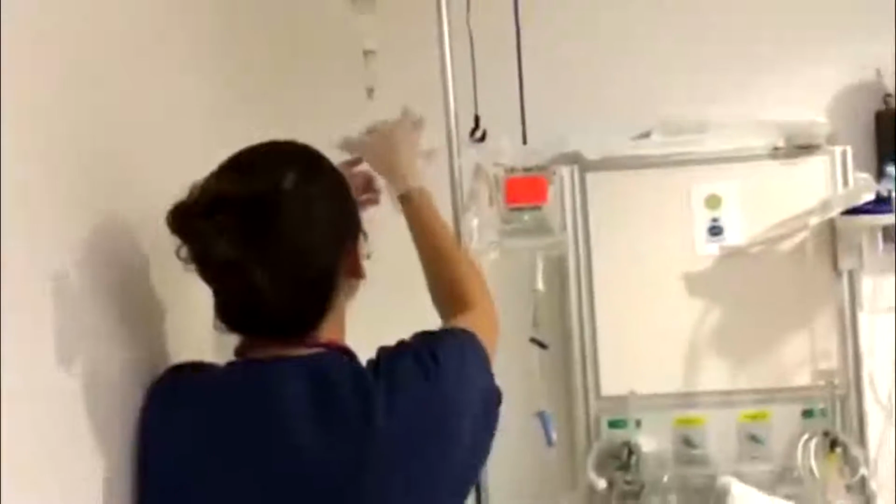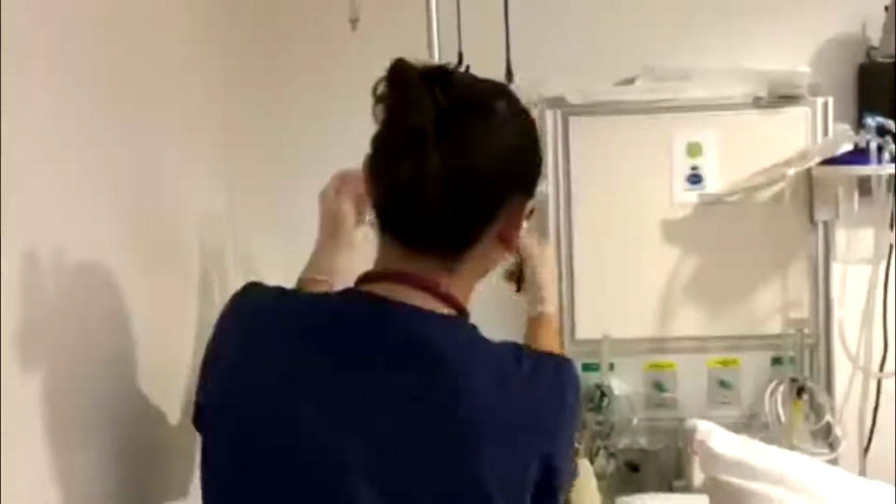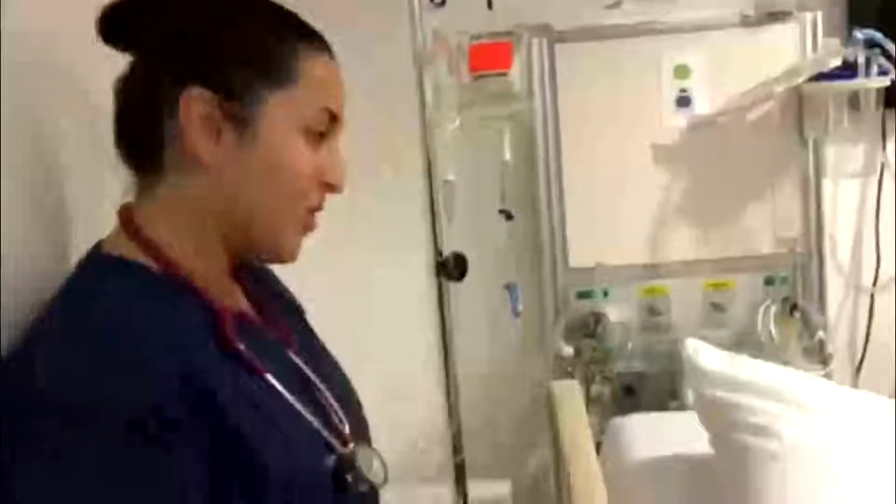Alright, so there are no bubbles, and if there are, we'll just take them out. And then I'll unclamp both solutions. Make sure that they're both running. Okay, Mr. Sweetheart, everything's running.